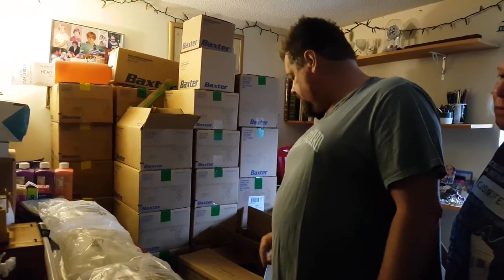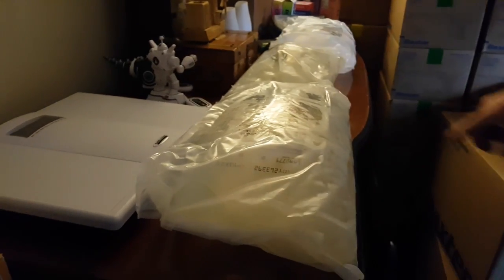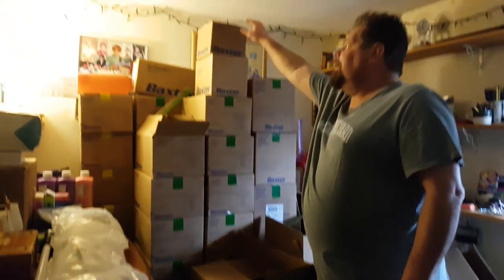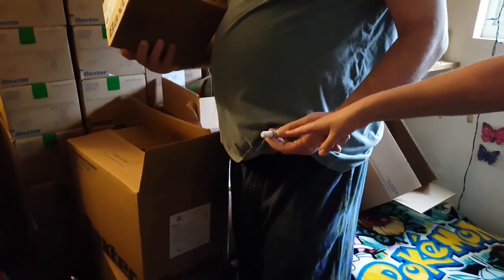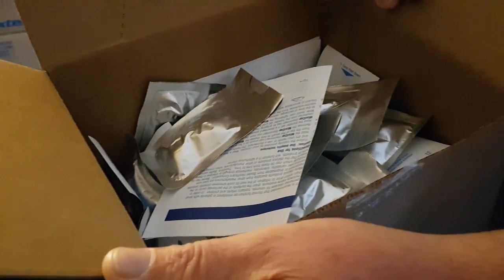Yeah. There is a protective bag over each of these. So actually right now these can be up here because they're not getting contaminated. Yeah, I have to remove this outer shell before we get to the bag. And then this is a box of cassettes. This is a box of mini caps, which are the little caps that protect you. That close it off when you're done. Protects your port. Yep. And the main thing is to keep it clean and sanitary. That's the main thing, because you don't want an infection. That's your worst enemy.